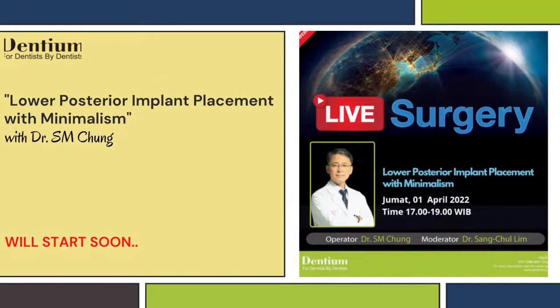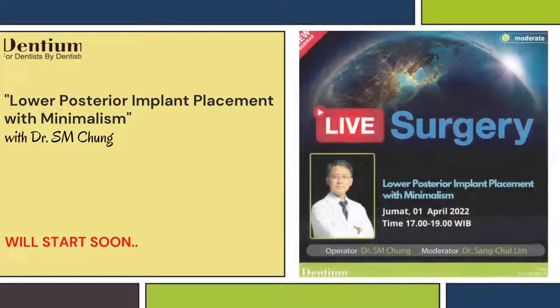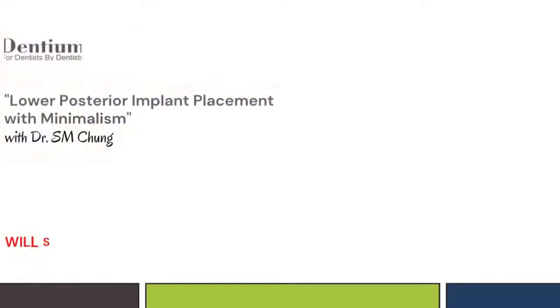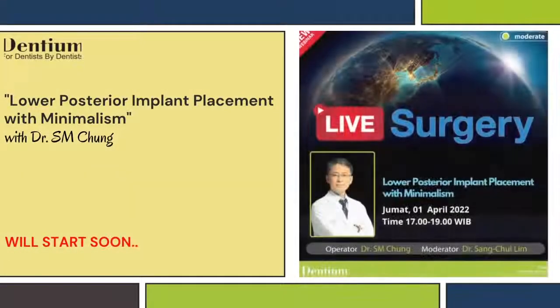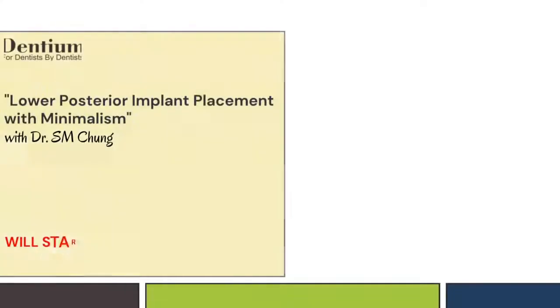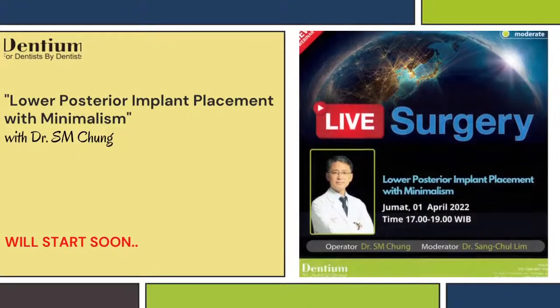As you can see, from number 47 to number 37, all the CT scan views show a very loose trabecular pattern, right? Because this patient is an elderly person.